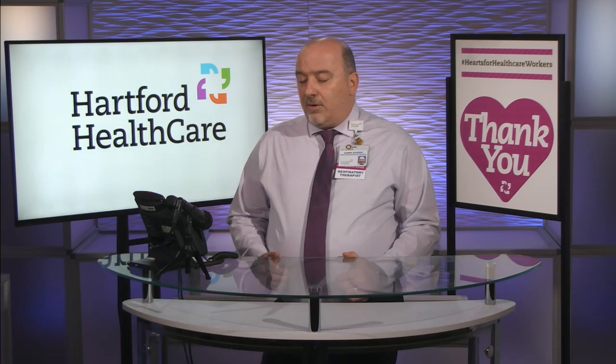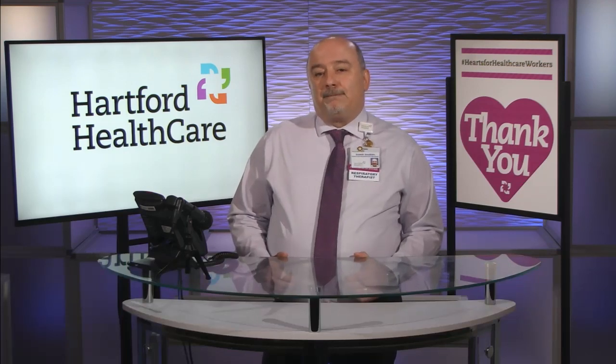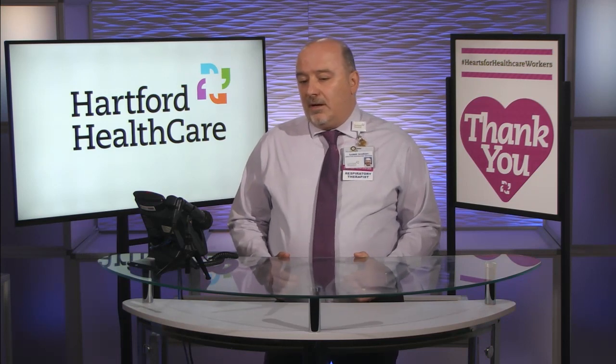Are there downsides, or what are the dangers of using this kind of technology? Why isn't it the status quo to use something like this? Normally the standard would be to have one device per patient, to be compliant with infection control and standard procedures. We do not use this on a regular basis. This is only for emergency situations. The dangers can be a variety of items, which can vary from patient to patient. That's why it's important to evaluate all the variables among the critical care physicians and the healthcare team.